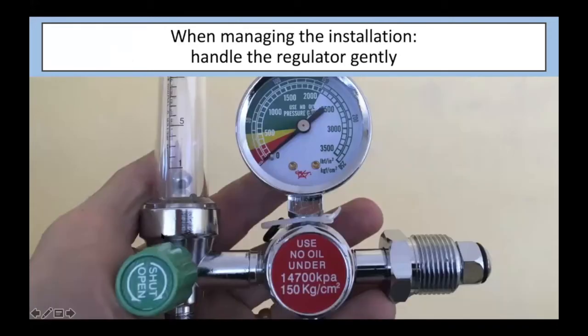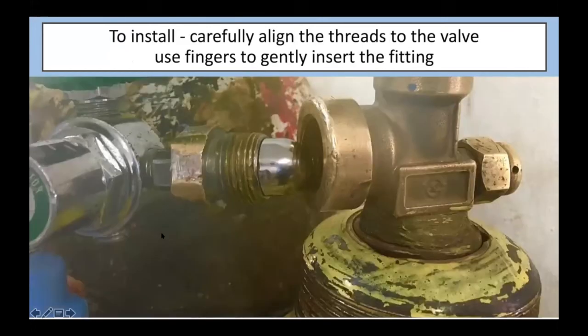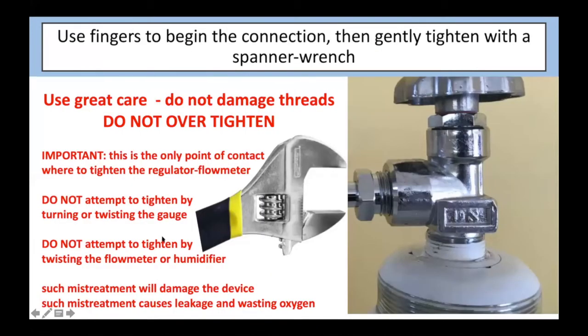So most importantly, and this is something that I really want to strongly share in this session, when handling and managing the installation, handle the regulator gently. This is a relatively delicate piece of equipment, and so we want to treat it with great care to prevent damage and the potential failure of the device in the future. So when installing, carefully align the threads to the valve. Use your fingers to gently insert the fitting. Just gently insert it and use your fingers to tighten it. Use fingers to begin the connection and then gently tighten with a spanner wrench.